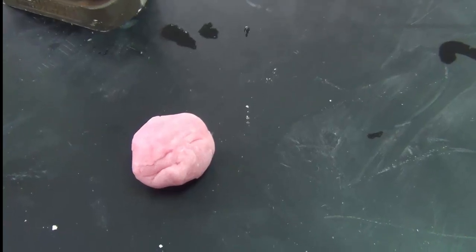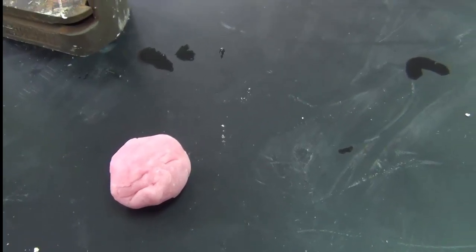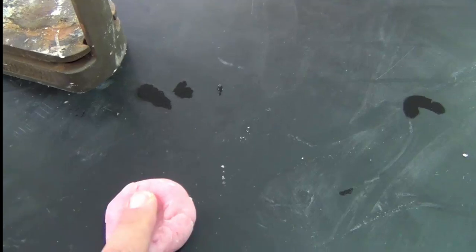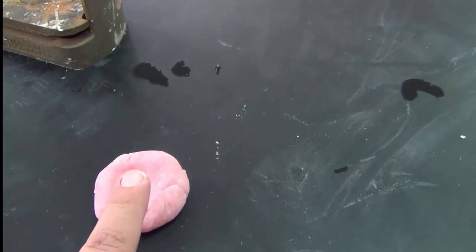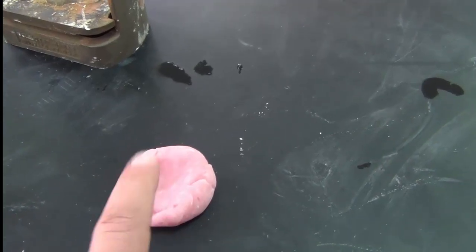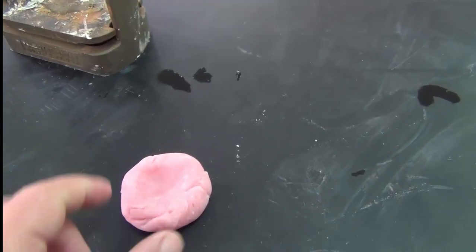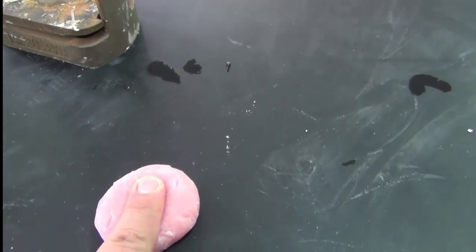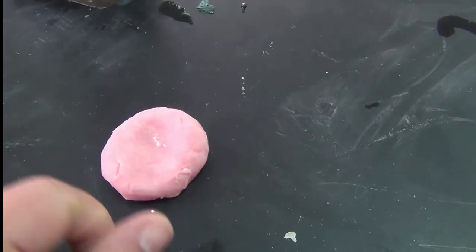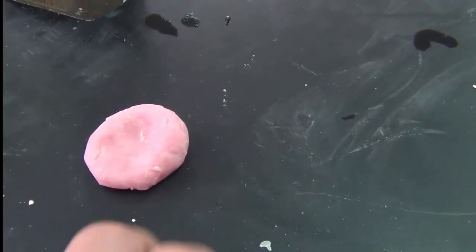If you see this excess that we had from the packing procedure, it's now running into the rubbery stage, so it's good to show it to you. Okay? Notice that when I apply my finger pressure on this, it springs back. Notice the springing back. It goes back to its original shape.